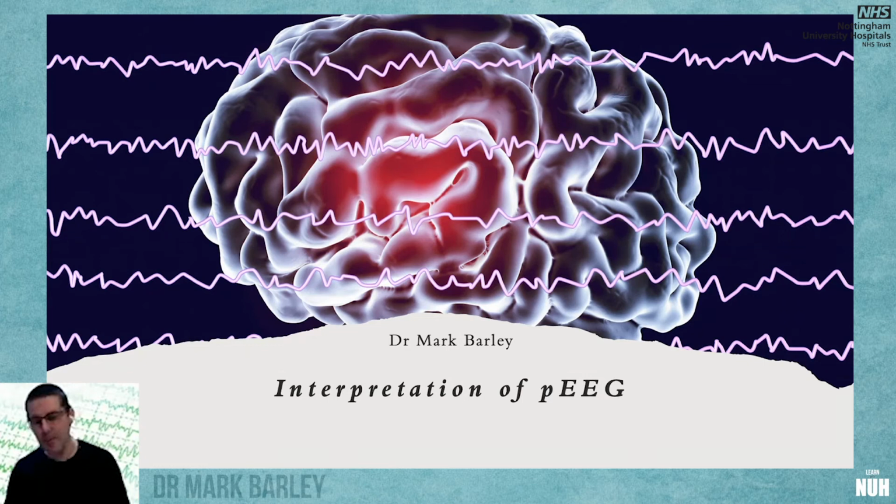An expert opinion from NAP5, from SIVA and the ASA recommends that we become familiar with the EEG during anaesthesia. It's a fascinating insight into mechanisms of action of the drugs that we use, a fantastic learning tool and an emerging insight into our patient's brain health and post-operative course, as well as potentially reducing the risk of accidental awareness under neuromuscular blockade.